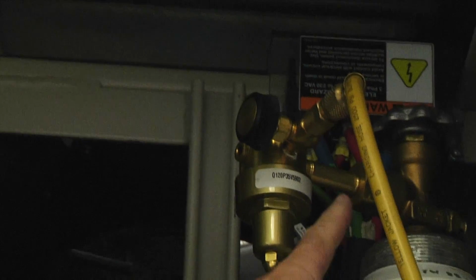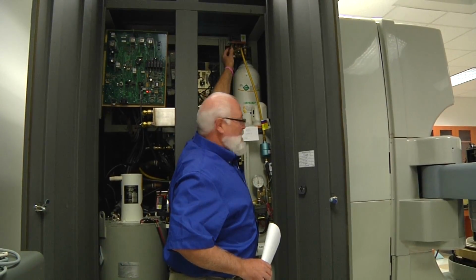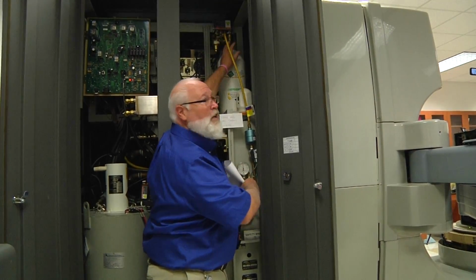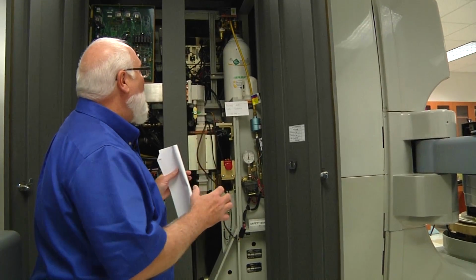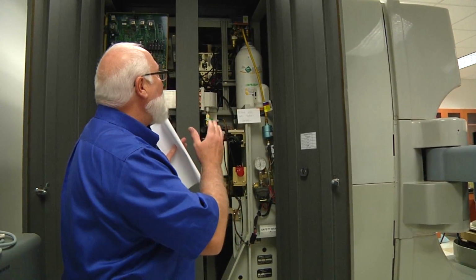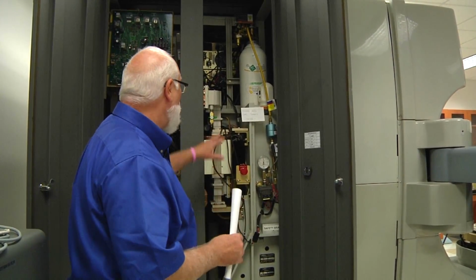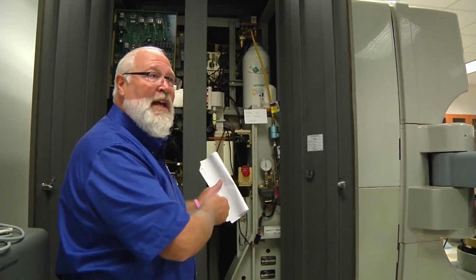It'll be taped up if it's the old style regulator. So we have you open the valve on the top of the tank, and then this little black valve, we ask you to open that. This meter will fill to a certain point. Should shut off between 32 and 34. And then you close this and you close the other valve. Why we have you close the valve, it's designed to auto-fill. You won't know if you have an SF6 leak until your tank's empty. So if we have you close the tank and only fill it when you need it, then you can tell us, well, I'm adding gas every morning. Well, that's too much. That means you have a leak in one of these flanges someplace. So your engineer will come out and he has a detector. He'll sniff around for that leak and then he'll probably replace a gasket.